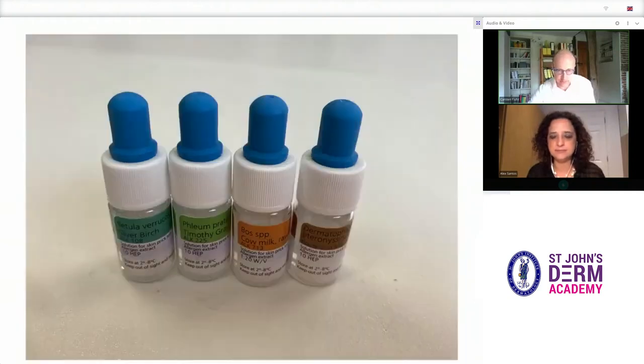Here are some examples of allergen solutions, some of which we're going to use in the demonstration. Standardised solutions to a wide range of allergens are available commercially. For more labile allergens, such as those found in fruits and vegetables, fresh proteins should be used.